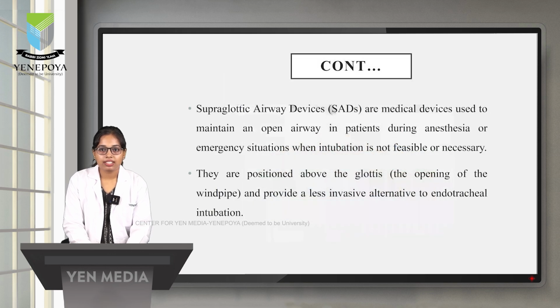Supraglottic airway devices are medical devices used to maintain an open airway in patients during anesthesia or emergency situations where intubation is not feasible or necessary. They are positioned above the glottis, the opening of the windpipe, and provide a less invasive alternative to endotracheal intubation.